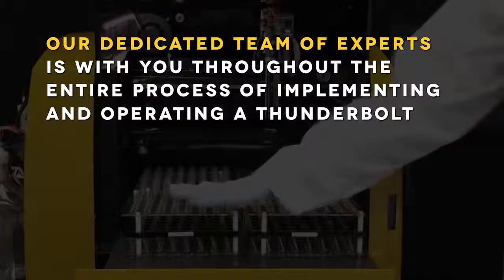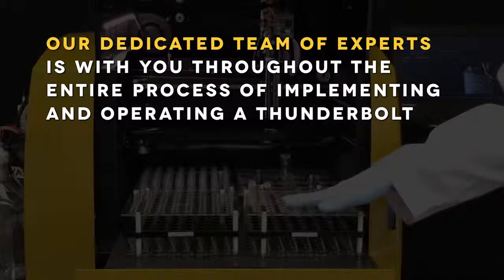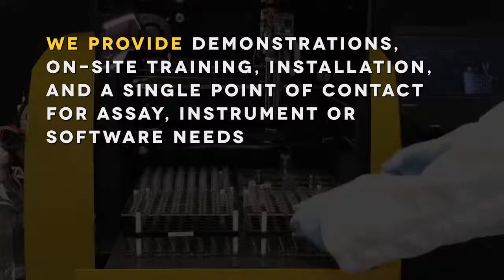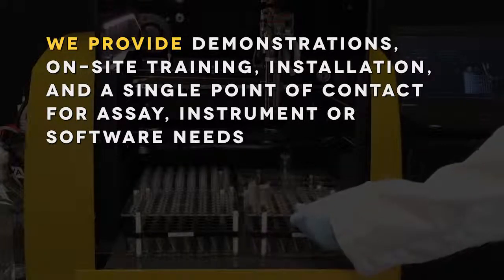Our dedicated team of experts is with you throughout the entire process of implementing and operating a Thunderbolt. We provide demonstrations, on-site training, installation, and a single point of contact for all assay, instrument, or software needs.